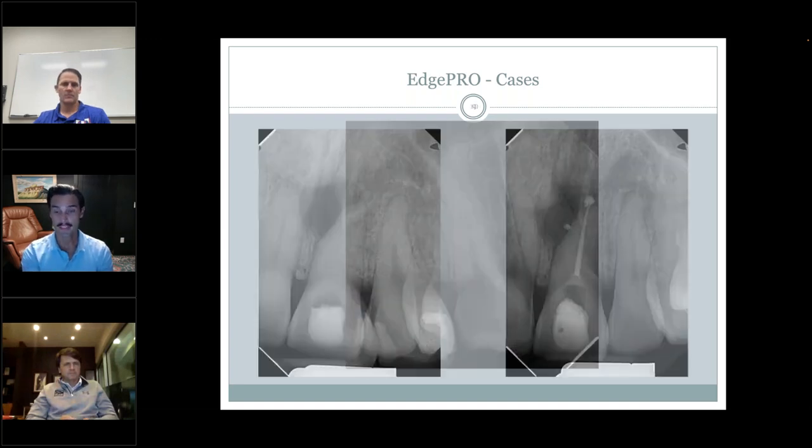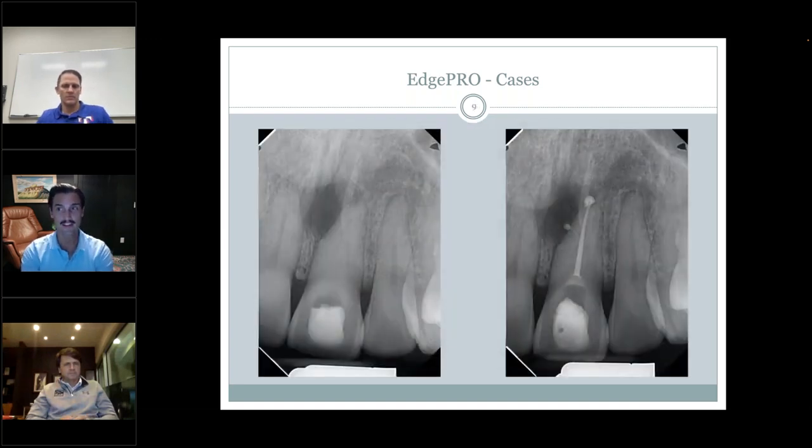And that would have been this case right here. Had I done traditional endodontics, this would have been another one that would have been a 2-visit case for me. I would have tried to place calcium hydroxide, probably use some hydraulic forces to pump the calcium hydroxide and try and fill the lateral canal, and then bring the patient back.